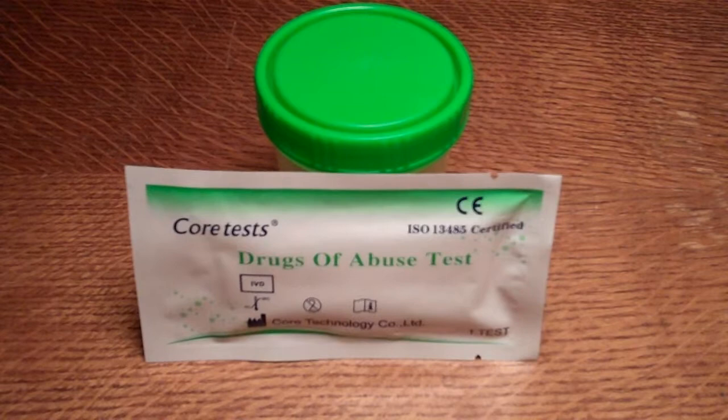What we're going to demonstrate in this video clip is how to conduct a cannabis drug test cassette urine drug test. The product we're going to be demonstrating on is a Core Test drugs of abuse test. It's a single cassette test. It's CE marked and it's ISO certified.